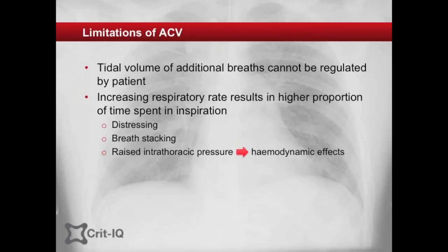Theoretically, the ventilator assumes that the raised respiratory rate always implies that the patient needs further respiratory support. However, for some patients this is not true. In patients with significant tachypnea due to non-pulmonary reasons such as pain, anxiety or delirium, the additional ventilation may result in overventilation, distress and respiratory alkalosis.